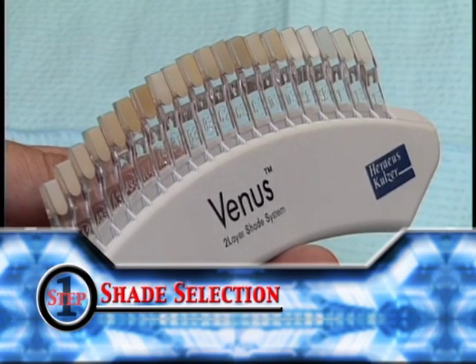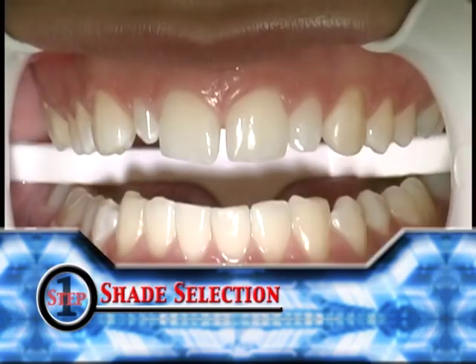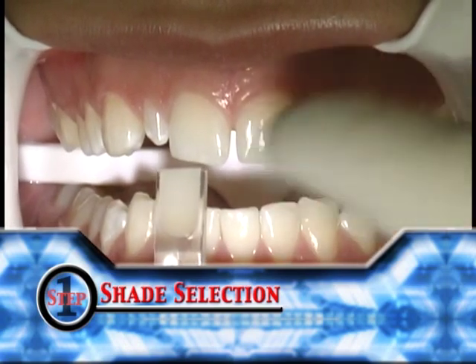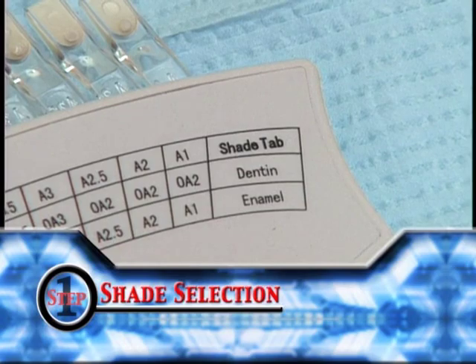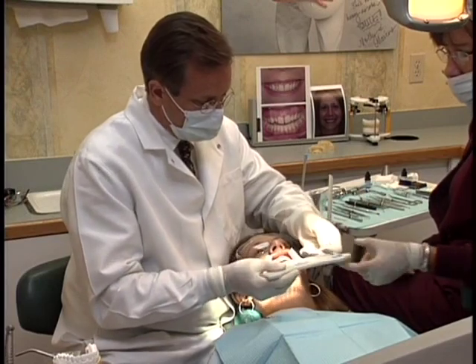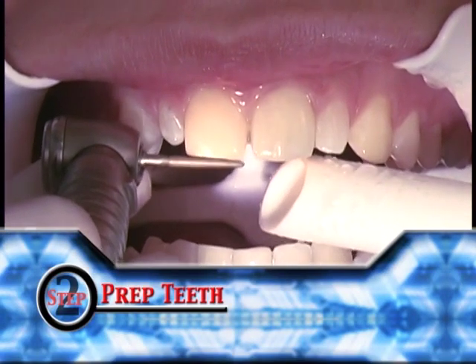Please note that all the shade tabs, with the exception of the translucent shades, are already layered. The dentin shades are opaque and will completely cover any underlying discoloration. The back of the shade guide provides you with the formula for creating the layered shades you and your patient desire. The next step is to prep the incisal edges using a veneer burr.